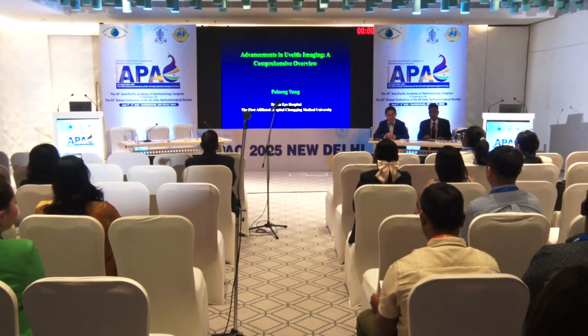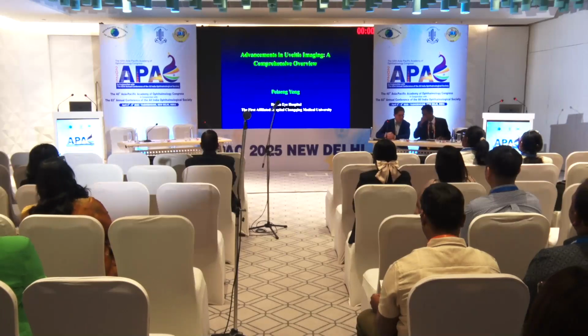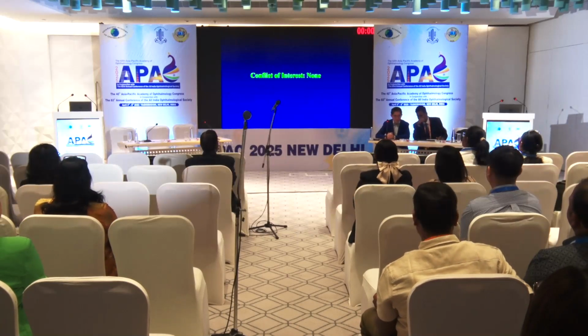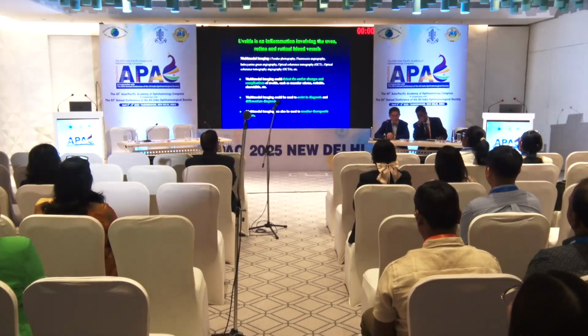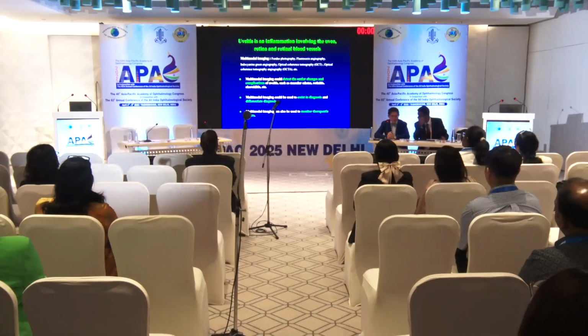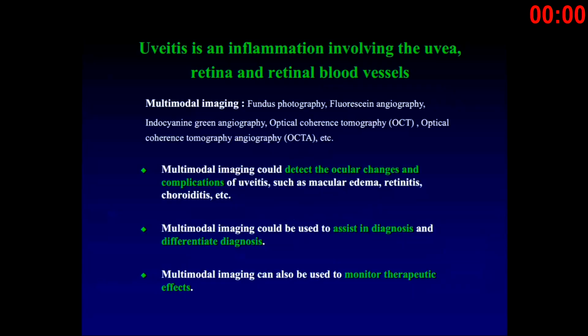My presentation is Advancement in Uveitis Imaging, a comprehensive overview. Uveitis is an inflammation involving the uvea, retinal blood vessels. Its diagnosis relies not only on clinical manifestations, but also on ocular imaging. In recent years, advances in multimodal imaging have significantly contributed to the management of uveitis.